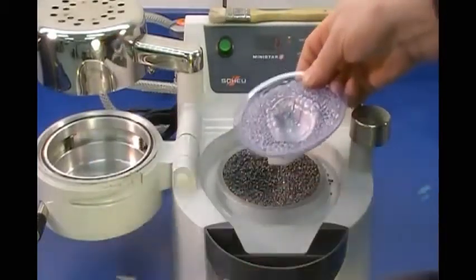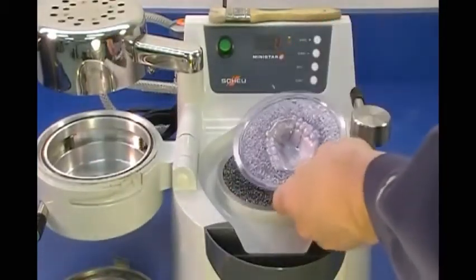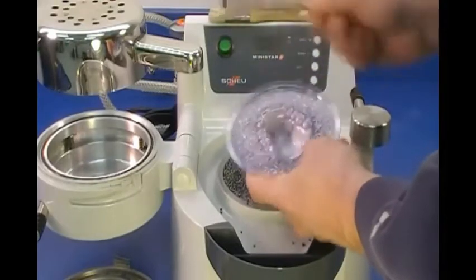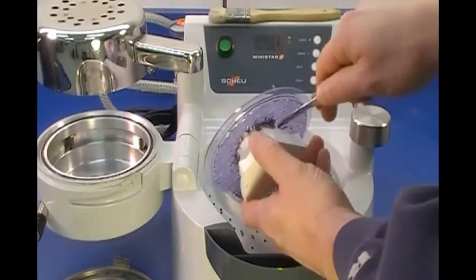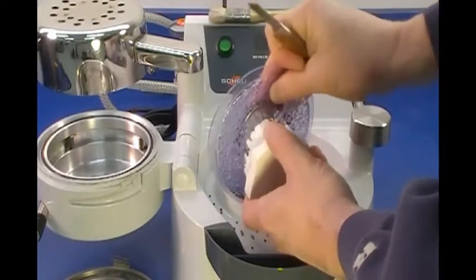Some pellets may stick to the formed material. Remove pellets with lab knife. Then loosen the wires that were held in place with wax along the facial surface of the model and remove formed plastic.